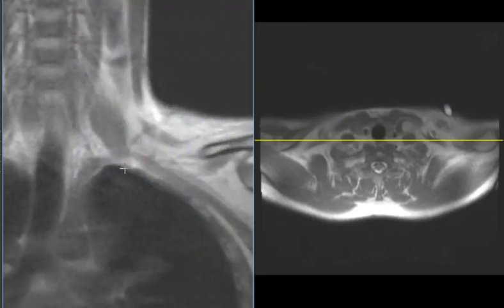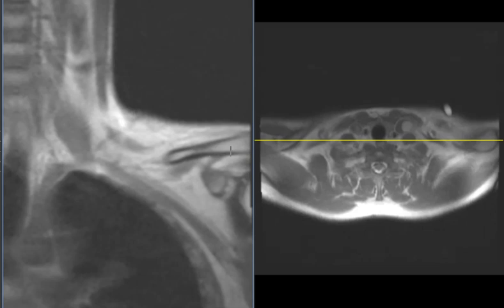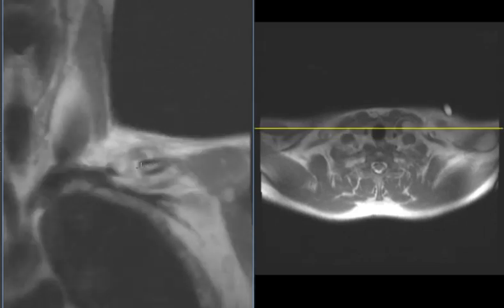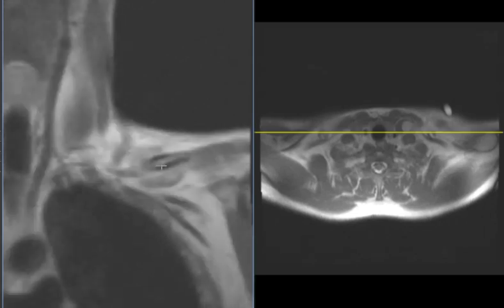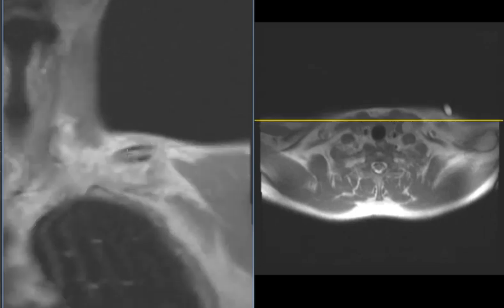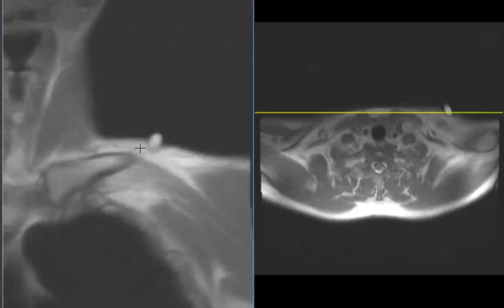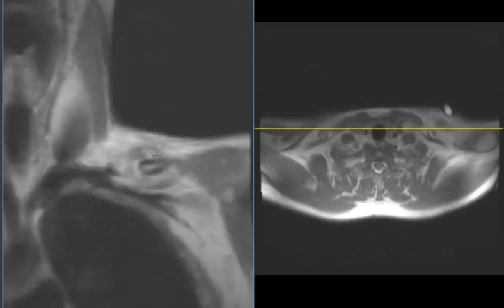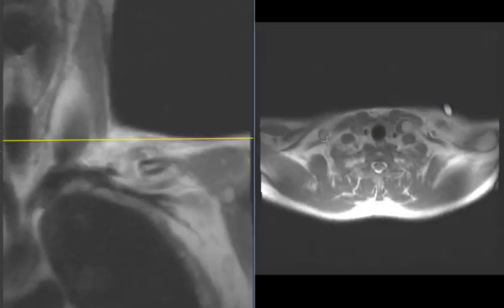Now we're going to look at the opposite side, left clavicle. And we see the outside. This is a clavicle coming across. Here's the mid shaft. And we say, wait a minute. Where's the continuity? So right here we have a fracture of the clavicle. And here's the other piece of it right here. It continues across here. So this gentleman has a marker over where he's having symptoms right there, that white dot. And he has a displaced fracture of the clavicle right there.